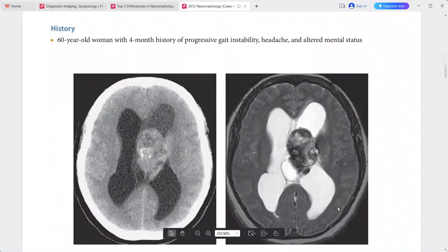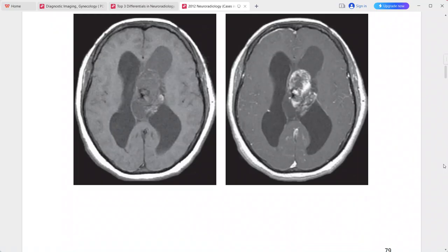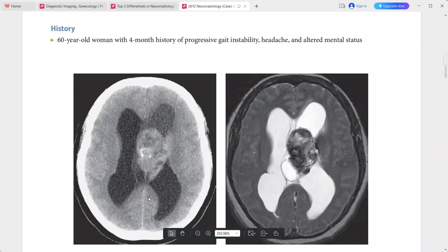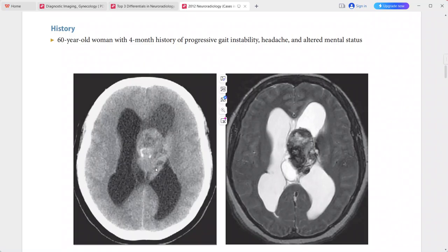Next: a 60-year-old woman with 4 months of progressive gait instability, headache, and altered mental status. There is a large solid and cystic mass within the body of the left lateral ventricle causing obstructive hydrocephalus. On non-contrast CT, the mass shows mild general hyper-attenuation and foci of coarse calcification.